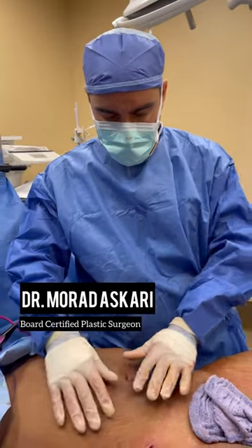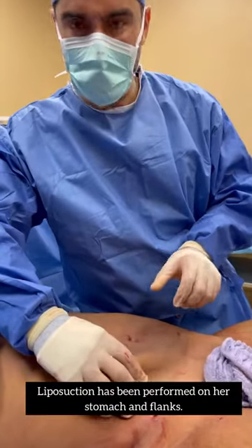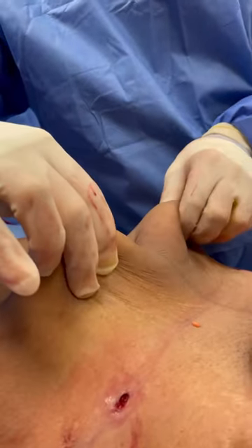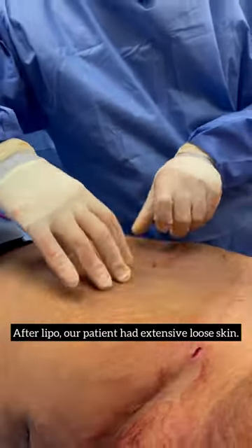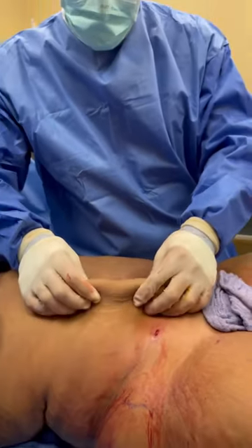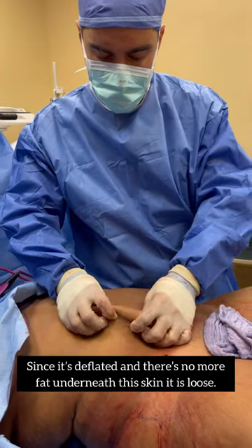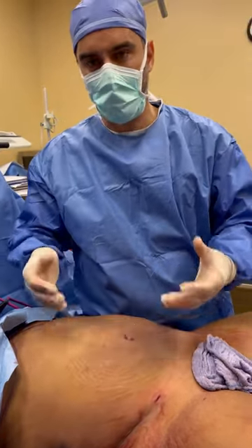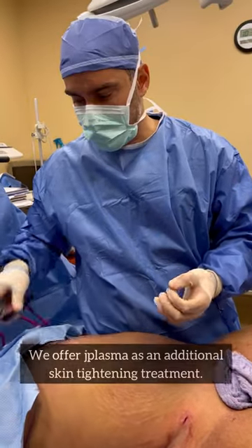We've done pretty extensive liposuction here in the abdomen and the flanks — we haven't done the back yet. We're halfway through our lipo 360, but we have pretty much extensive loose skin here. This skin has stretch marks and obviously right now, because it's deflated and there's not much more fat underneath it, it's going to be loose. One technique we have to offer additional skin tightening is by use of J-plasma.